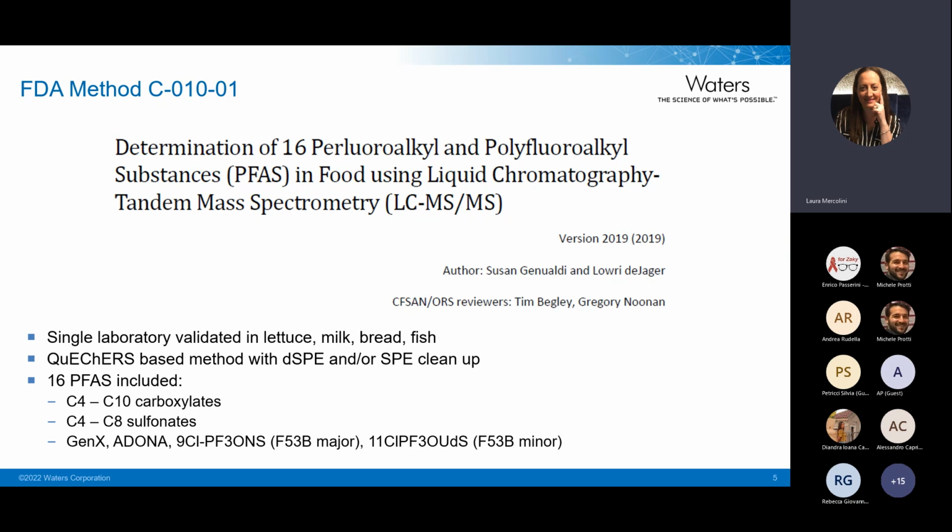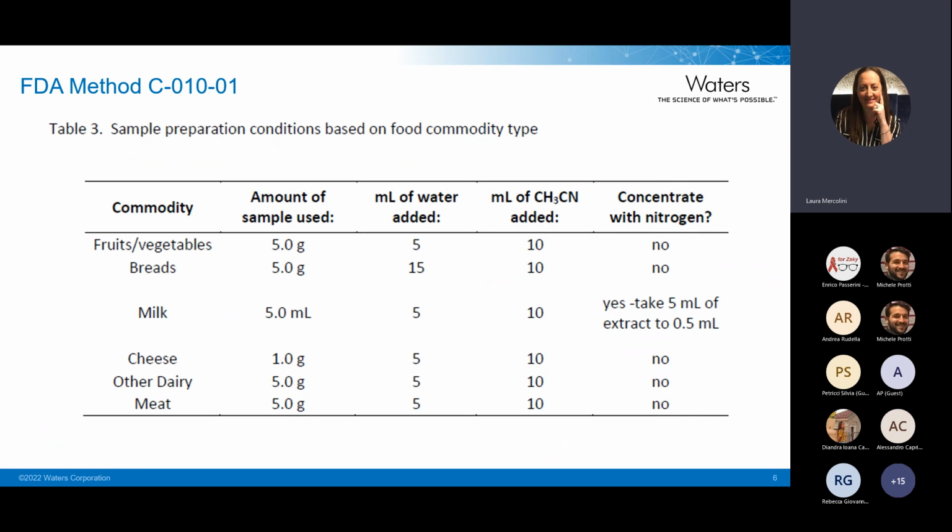For sample prep, they use QuEChERS followed by dispersive SPE. As usual, for example for pesticide determination in food, they publish guidelines on the amount of sample to weigh in the lab, and how many ml of water is enough to rehydrate samples.